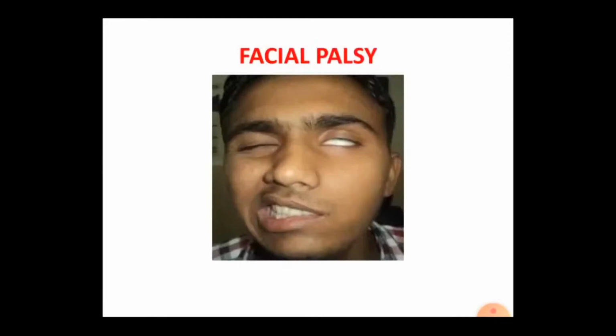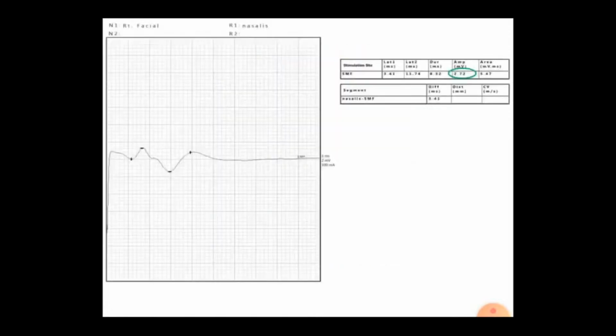Now let us see facial palsy. In this you can see that the patient is having one side palsy. Now this is the report for the right facial nerve recorded from the nasalis muscle. We have to see the amplitude, that is 2.72. The right side is normal for this patient, so 2.72 millivolt will be considered as the reference value. Now we have to compare this reference value with the left side, which is affected.